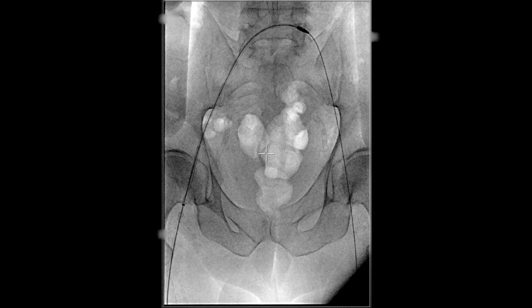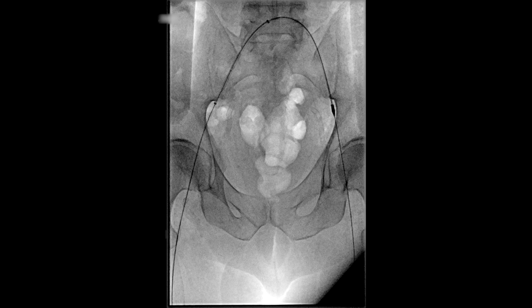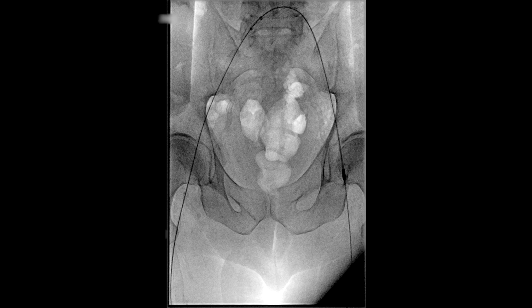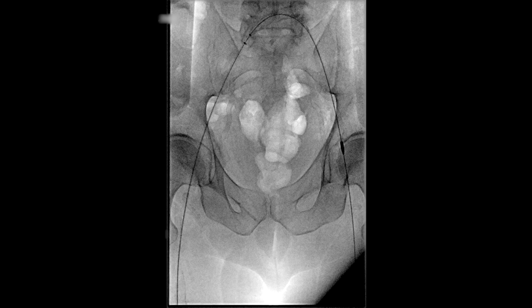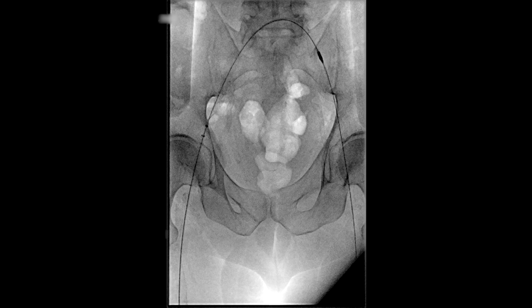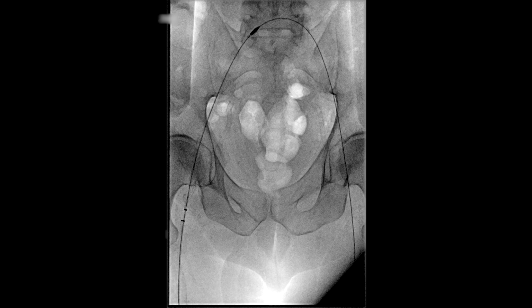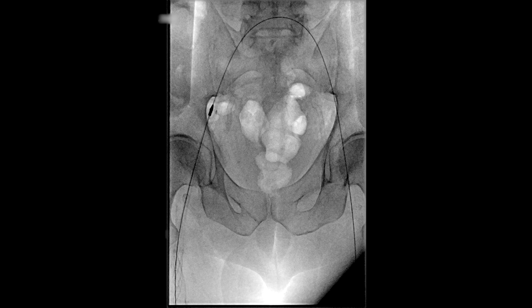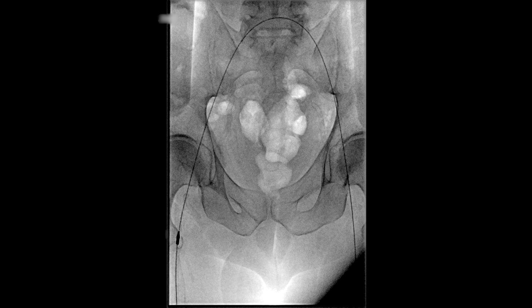Once the confluence is crossed, the two portions of the clot retriever are separated, and now you can see the forward portion of the clot retriever being advanced further into the patient's iliac veins and then ultimately the patient's right femoral vein. We then slowly retract our clot retriever to clear the patient's left iliac veins and femoral vein. Here you can see it being retracted. We repeat this several times in different orientations to allow for removal of thrombus in different orientations.